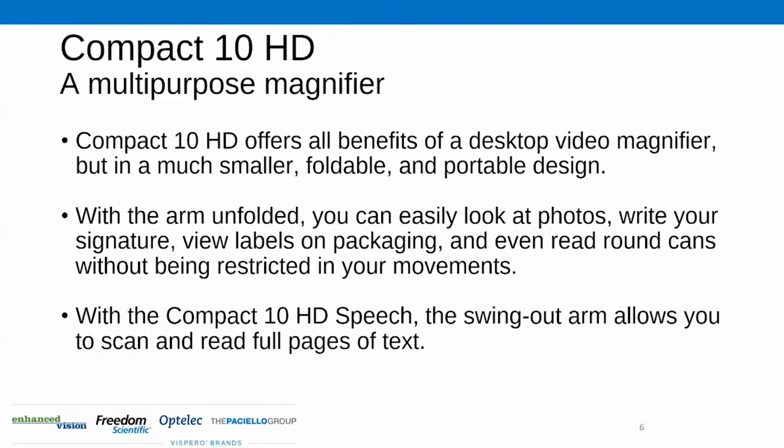So when the stand is down, and you may be looking at photographs, reading the mail, newspaper, flat material, essentially, it's going to know you're in that reading mode, and it's going to select the appropriate camera and viewing for that setup. And similarly, as soon as you have that arm extended, it's going to know that you have the arm extended, and it's going to switch the view. And you may want to read a book or write a check, a thank you card. It'll be much easier to view labels on packaging, round cans, essentially a really independent living tool that allows you to be independent in no matter what room of your house, wherever you are.